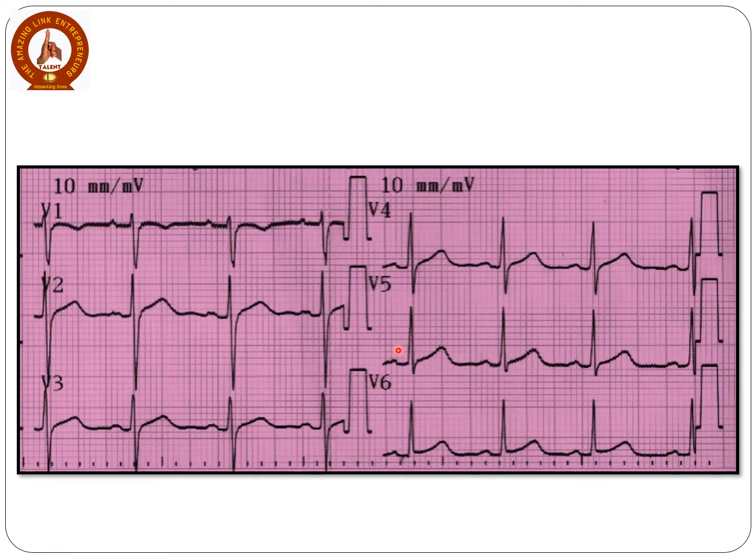Let's consider a few examples. Look at this ECG. V1 contains dominantly negative QRS complexes, so also V2. Lead V3 displays equiphasic QRS complexes. That means the transition zone is in V3. So this is normal transition. If you look at V4, V5, V6, they are dominantly positive. So the transition has occurred here. V3 is the transition zone, so this is normal transition.